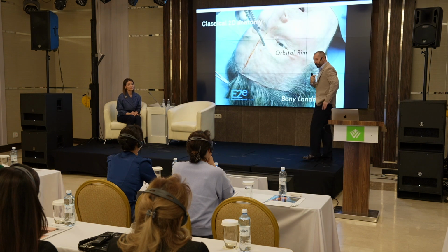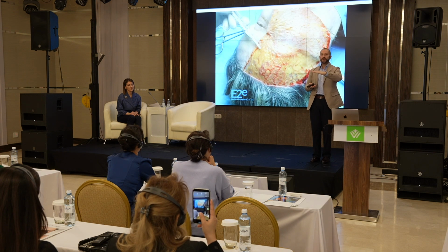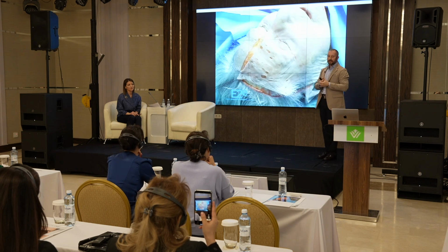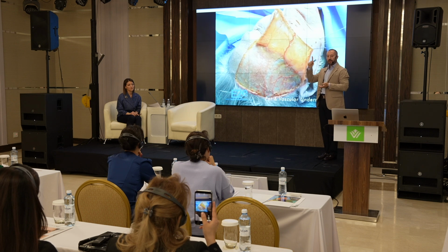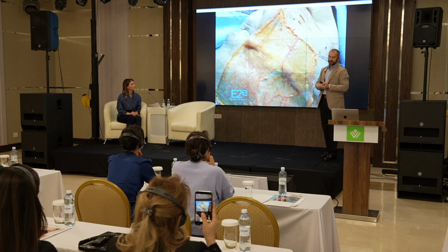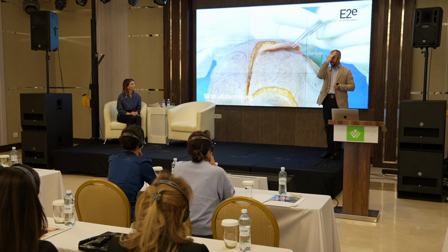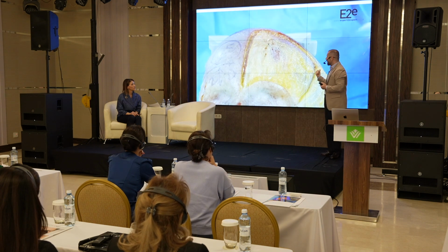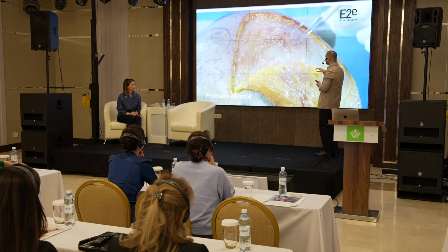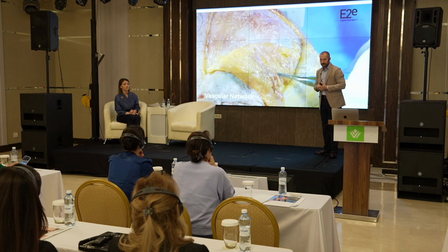The layers in the forehead are the classical ones I told you: deep to the bone, deep fat, muscle layer, frontalis muscle, superficial fat, and the skin. It is the same in the lower third and the middle third area, MLT technique area. You can see the skin, then superficial fat, and the frontalis muscle. And this is really important. We have a safety line here in the forehead, because I will explain why we have a safety line. When you remove the skin and superficial fat, it's a compartment, but it's not so important, I guess, for filler injections. And you can see the galea deep, and a little bit above is the frontalis muscle.